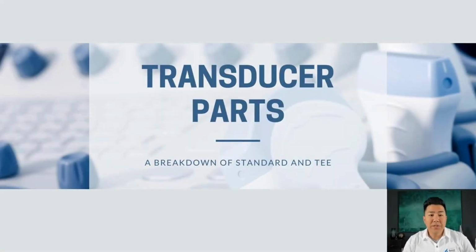Okay, we're going to move into the section where we're talking about probes, and in particular, we're going to group two types of probes together to speak about them in their generalities and all the different sections and parts that are in these transducers, to arm you with the information to talk about these and perhaps understand where you might be able to induce some of the failures that are more intermittent on the machines that you're working on in the field.